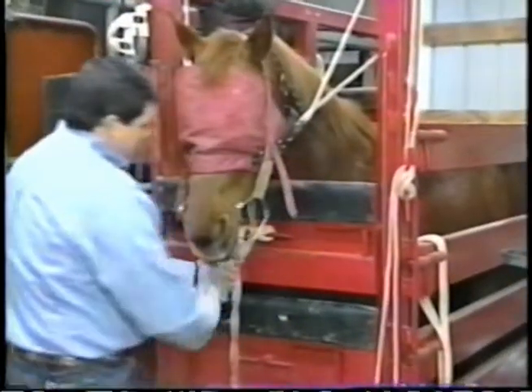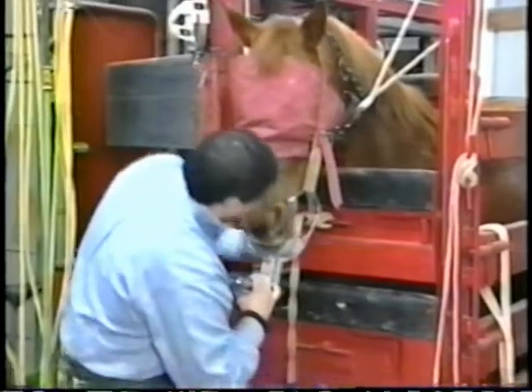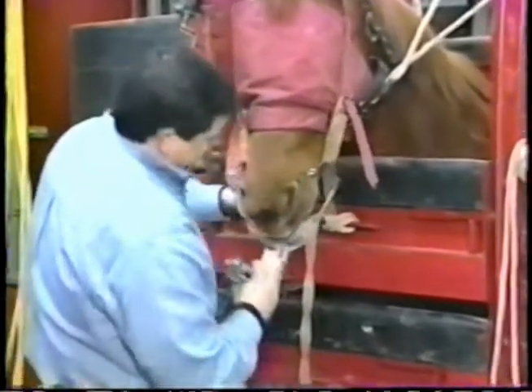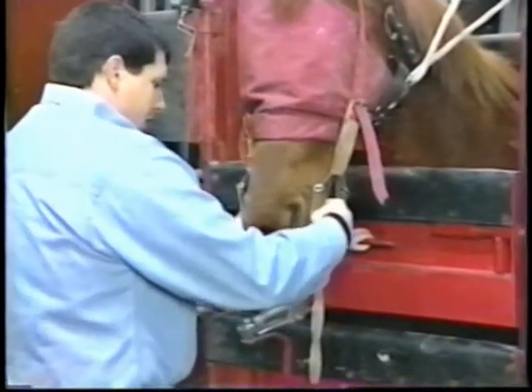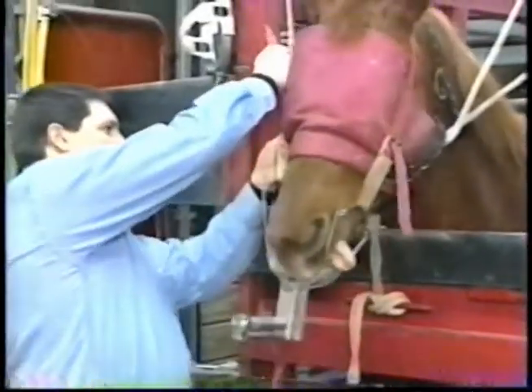Once the animal is sedated, we change halters. Then we fit the horse with a full mouth speculum so that we can view the back parts and the extent of the mouth from front to back.